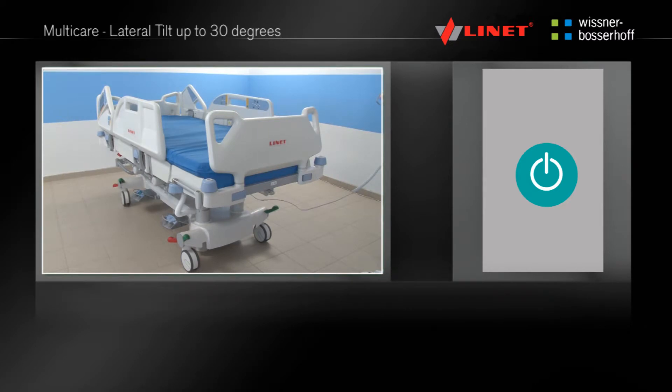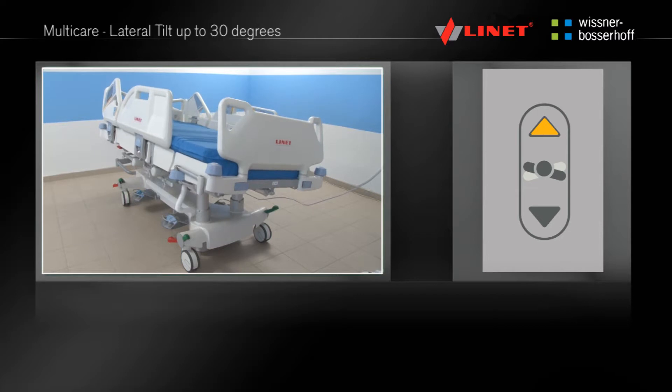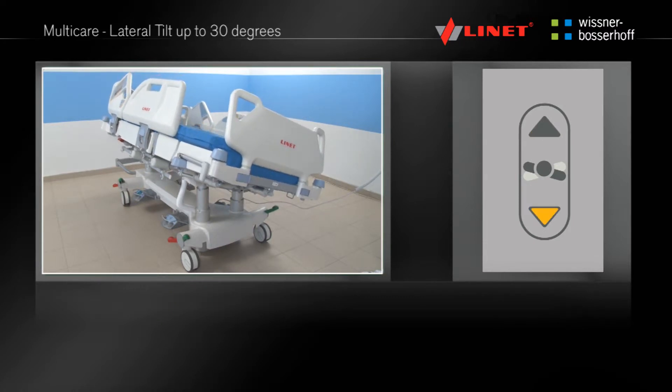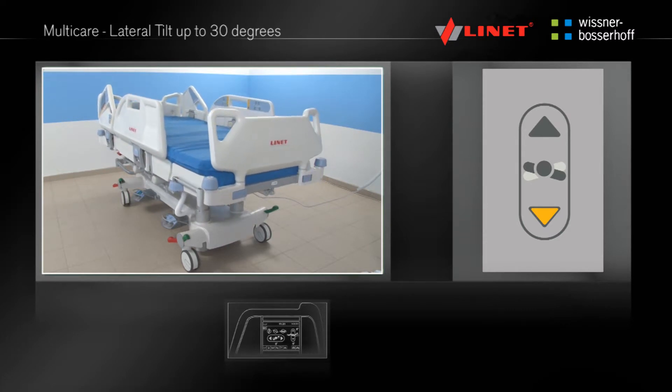Activate the function by pressing the Go button. Press and hold the function button until the desired tilt angle is reached. Lateral tilt can be positioned up to 30 degrees. This function is located on the Multiboard and the Supervisor panel.